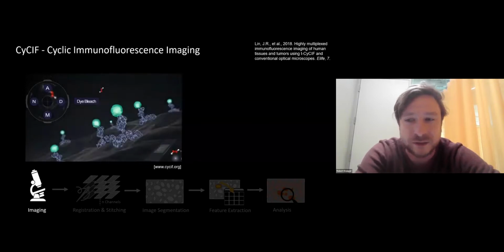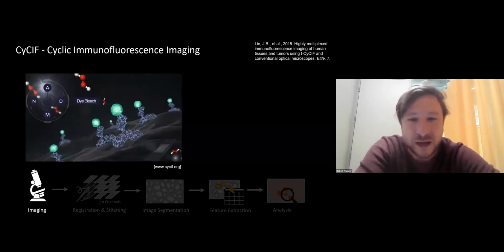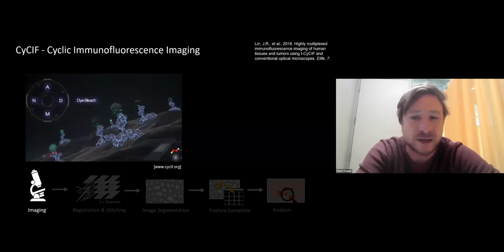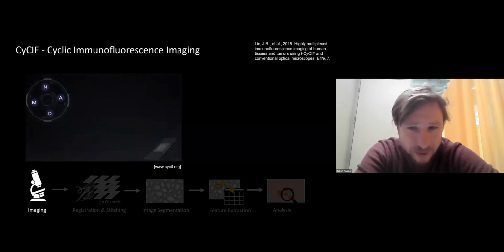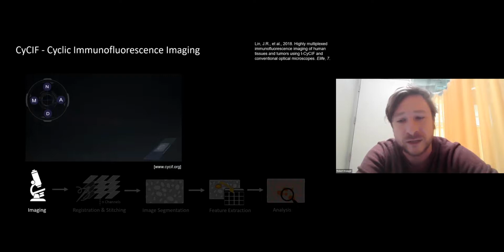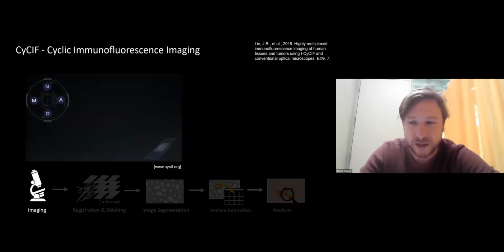The tissue is then imaged and digitized, yielding images encoding the location and the amount of various proteins at the level of individual cells. And then subsequently, the labels are chemically removed and the process is repeated with labels for different proteins. And this cyclic process is really key to measuring a large number of molecular features, which offer great insight into normal and also disease processes in cells.